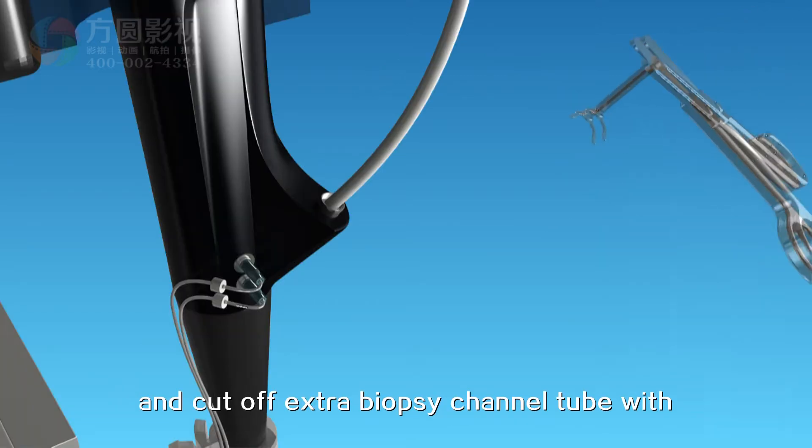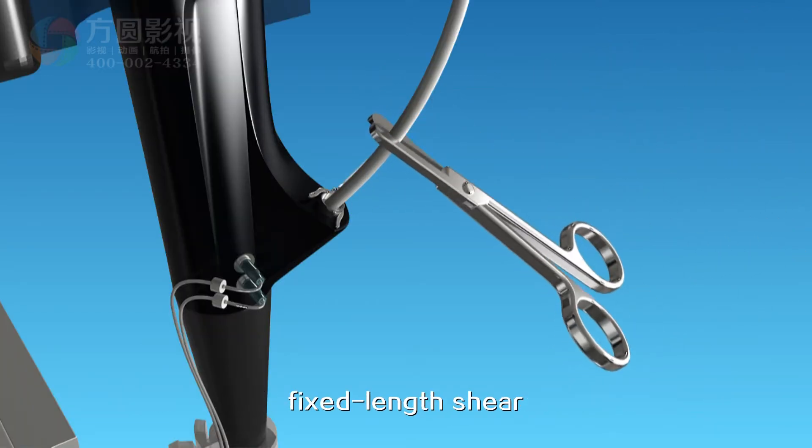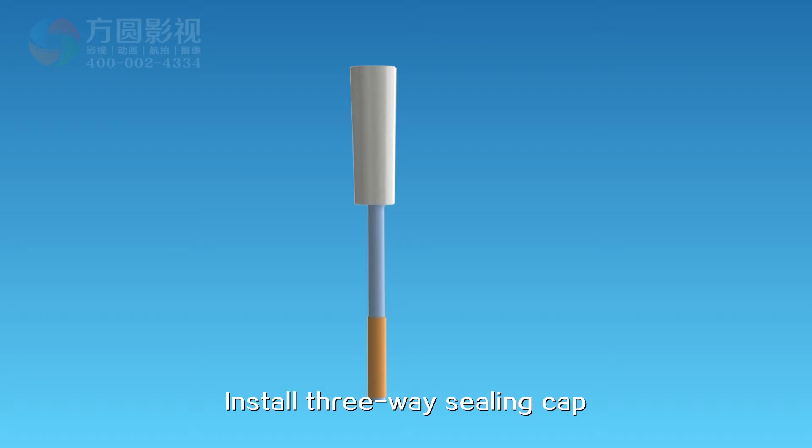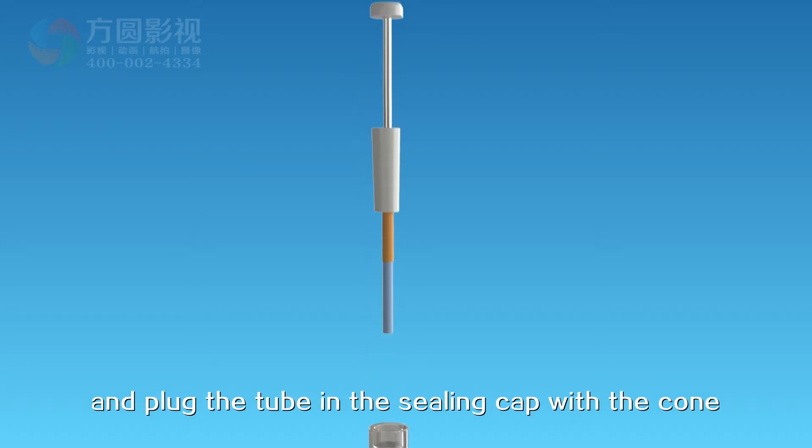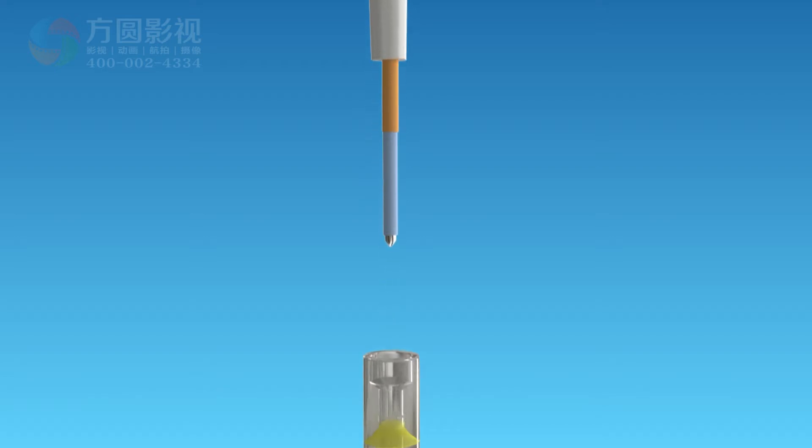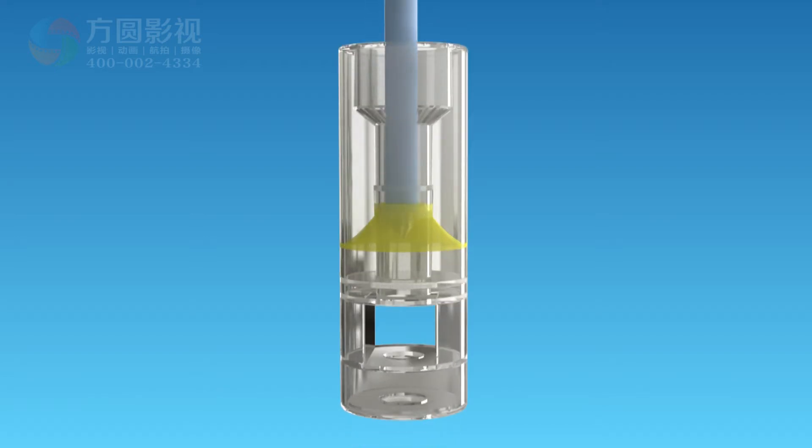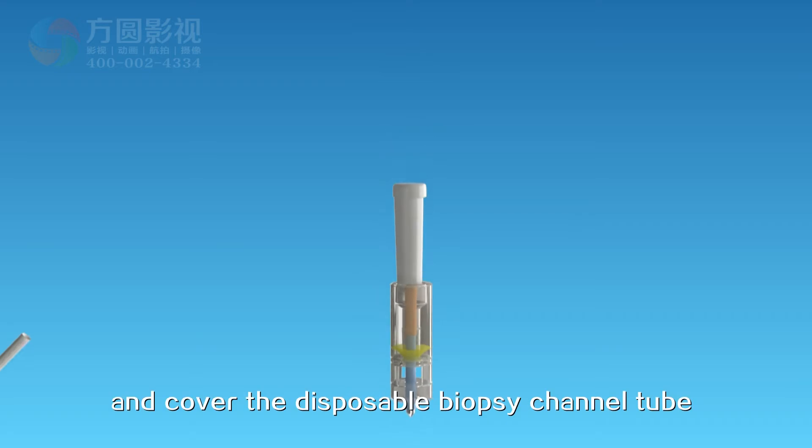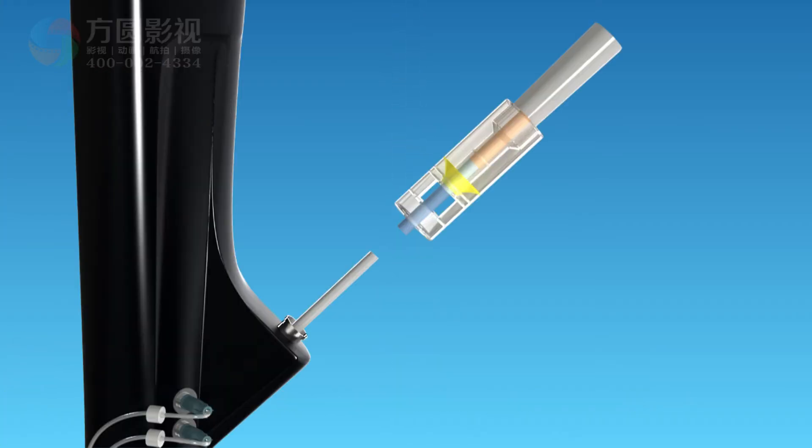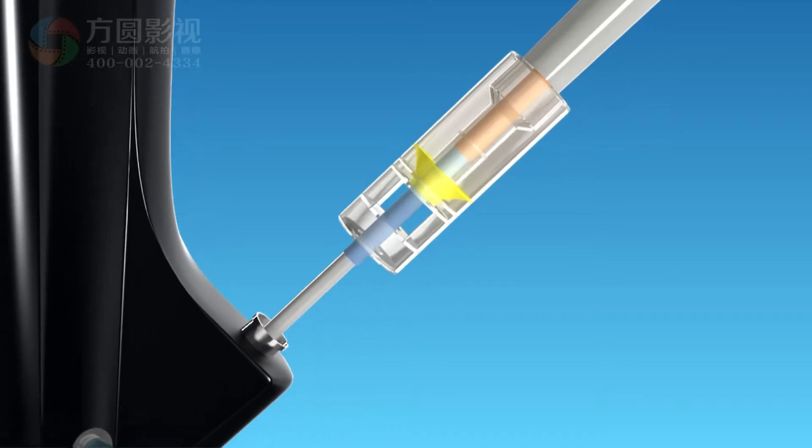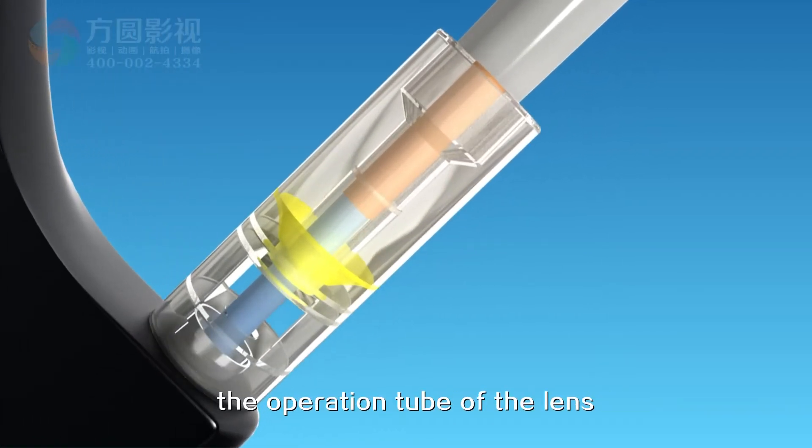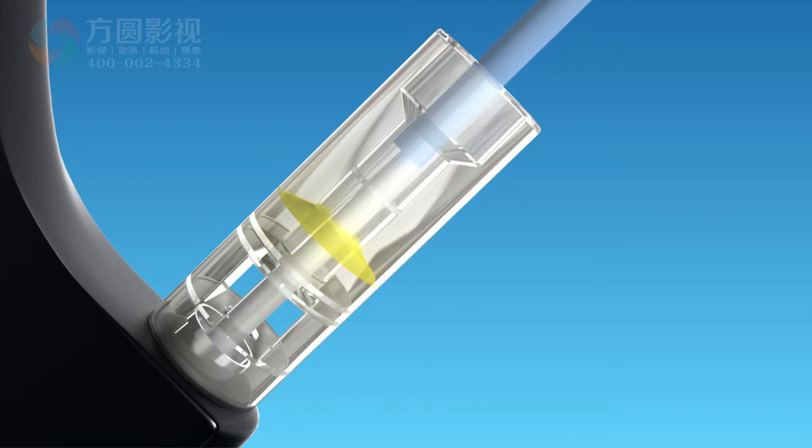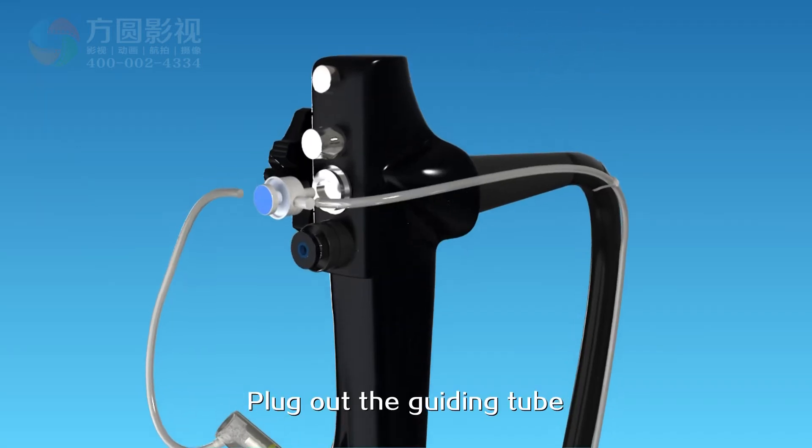Cut off extra biopsy channel tube with fixed length shear. Install the three-way sealing cap. Plug the guide cone in the tube and plug the tube in the sealing cap with the cone, then pull out the cone and cover the disposable biopsy channel tube with the front end of the guiding tube. Fix the three-way sealing cap outside the operation tube of the lens, pull out the guiding tube.